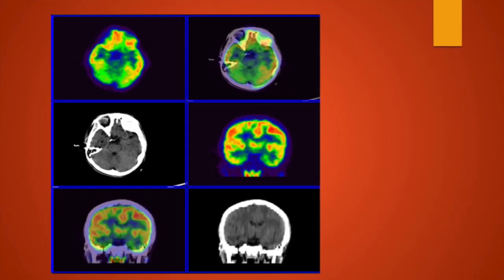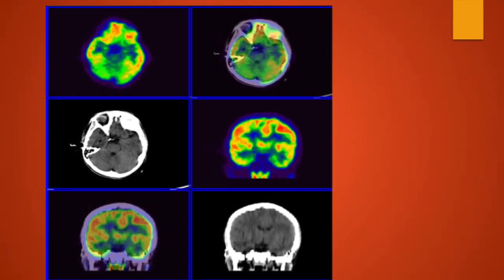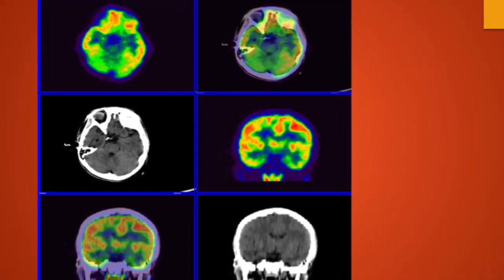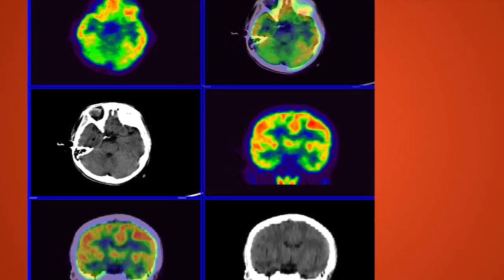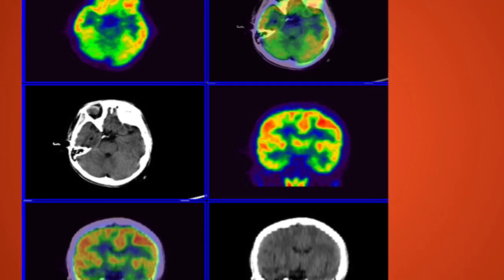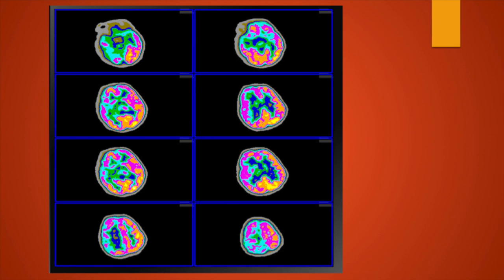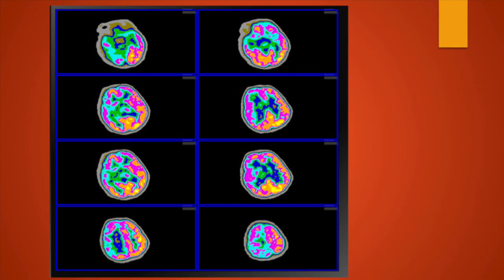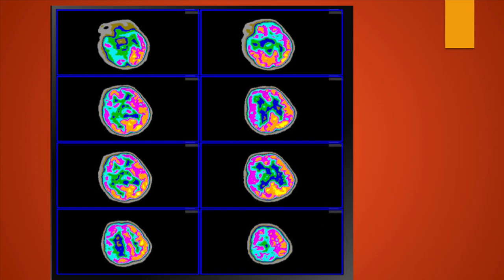This is another case of atypical Parkinsonism. Atypical means there is a disparity between the right and left sides and it is not classical Parkinsonism. There is a lot of hypometabolism seen in the cortices — in bilateral frontal and parietal regions — which is more prominent on the right side compared to the left side. Coming to the important aspect of quantification: the metabolic uptake in bilateral cerebral parenchyma is assessed based on SUV values. On the left side there is a chart showing the frontal lobe — left and right — with the mean SUV value.